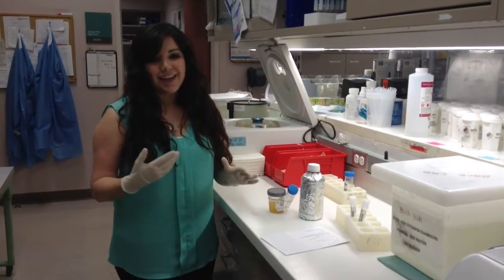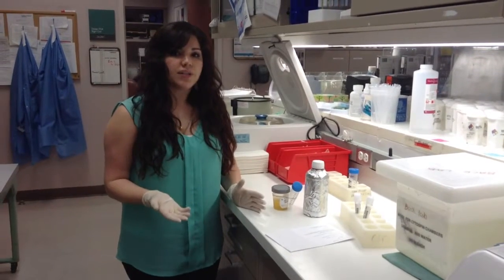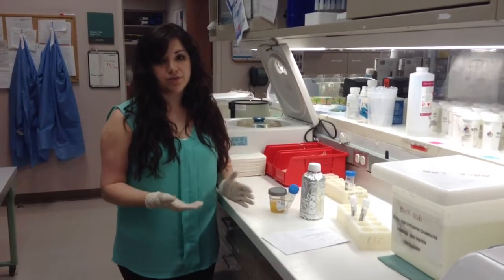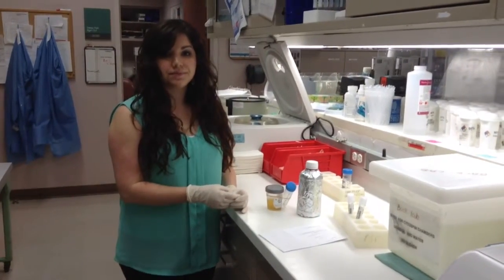Additionally, I would say that because urine specimens are not as difficult to recollect, it's probably okay to go ahead and start with live cases for urines, as long as you watch them at every step. And be sure to offer yourself to answer questions at every step as well.